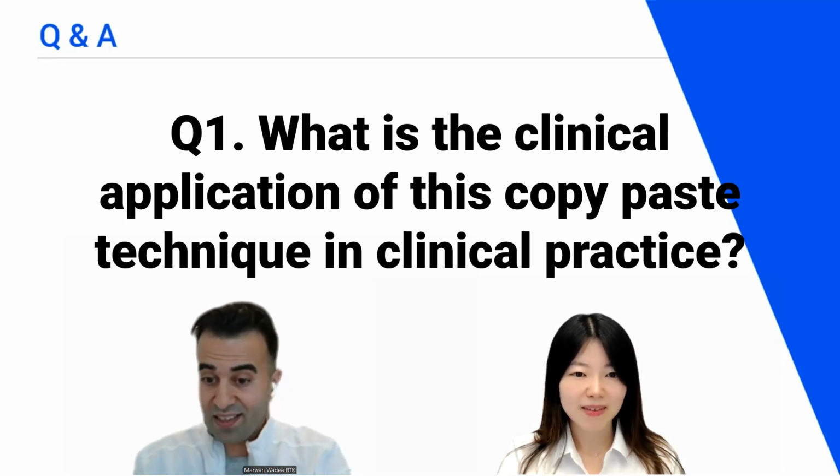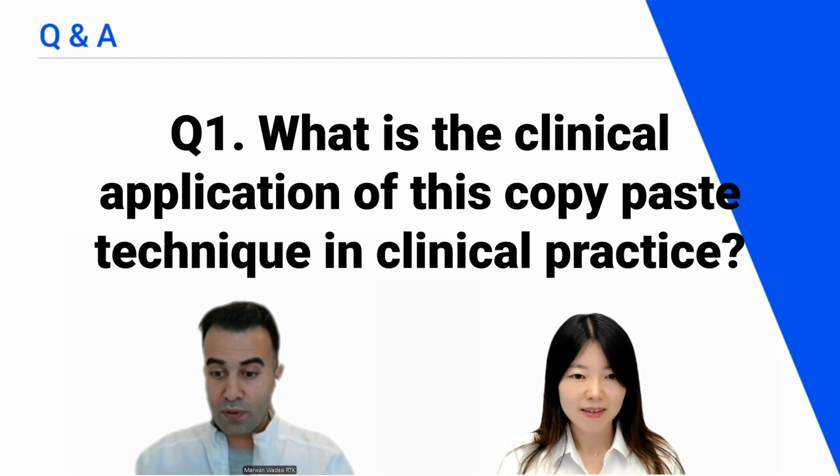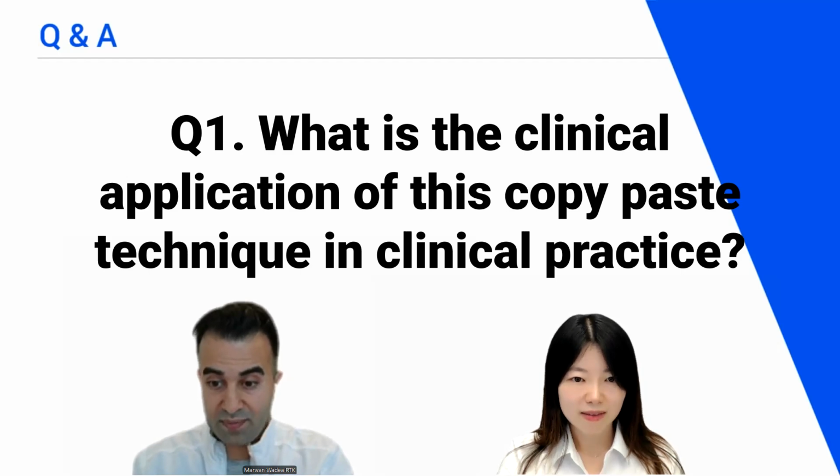I think it's really valuable, not only for dentures, even for ceramic. If we are working with monolithic milled ceramic restorations, we can do the same with the shapes, and technically copy-paste the teeth. I think there are so many clinical applications.